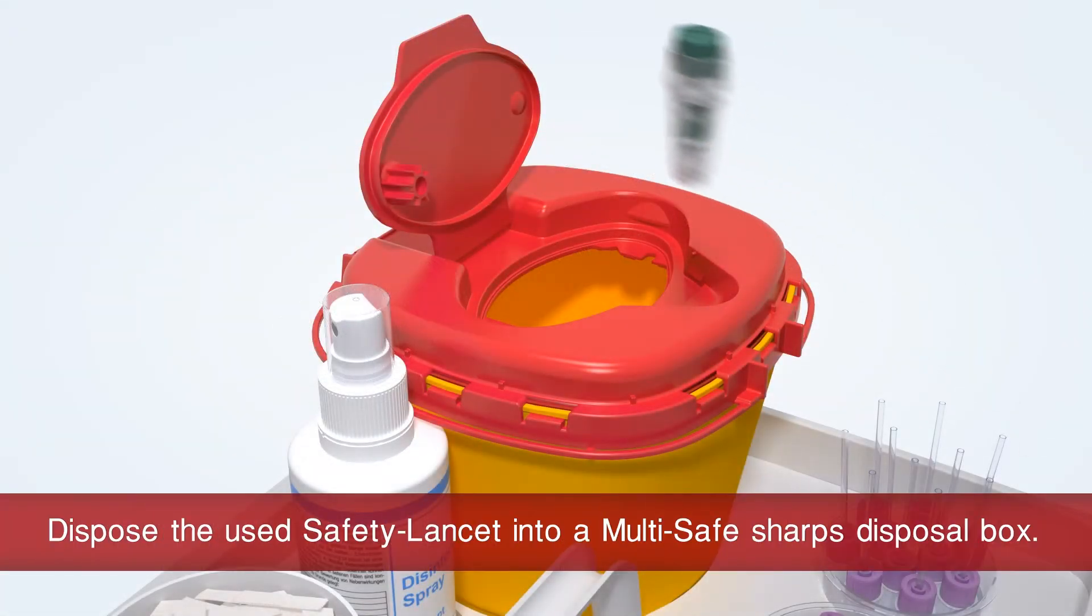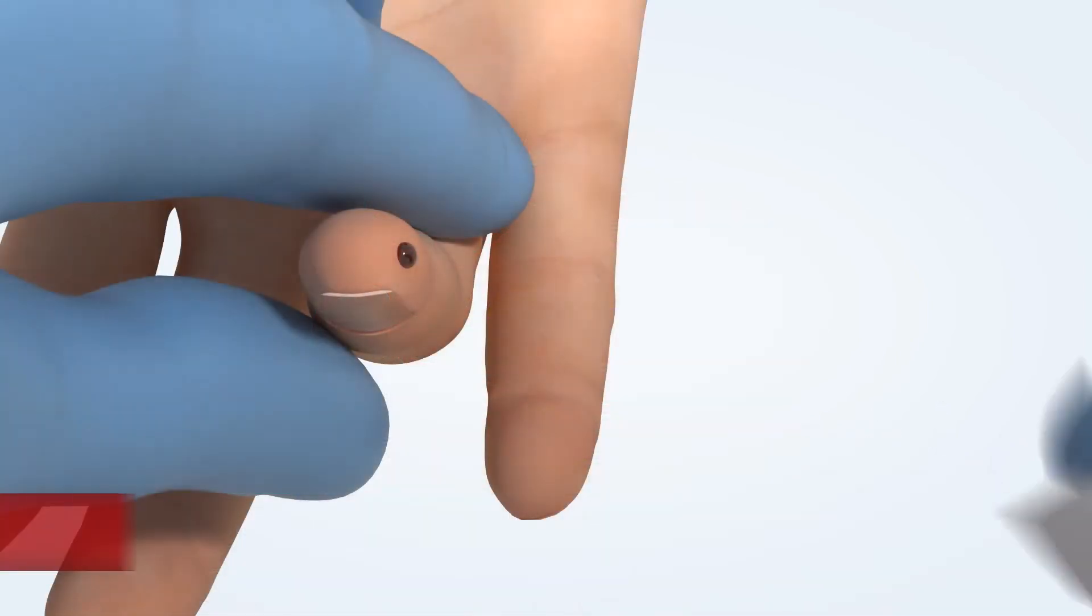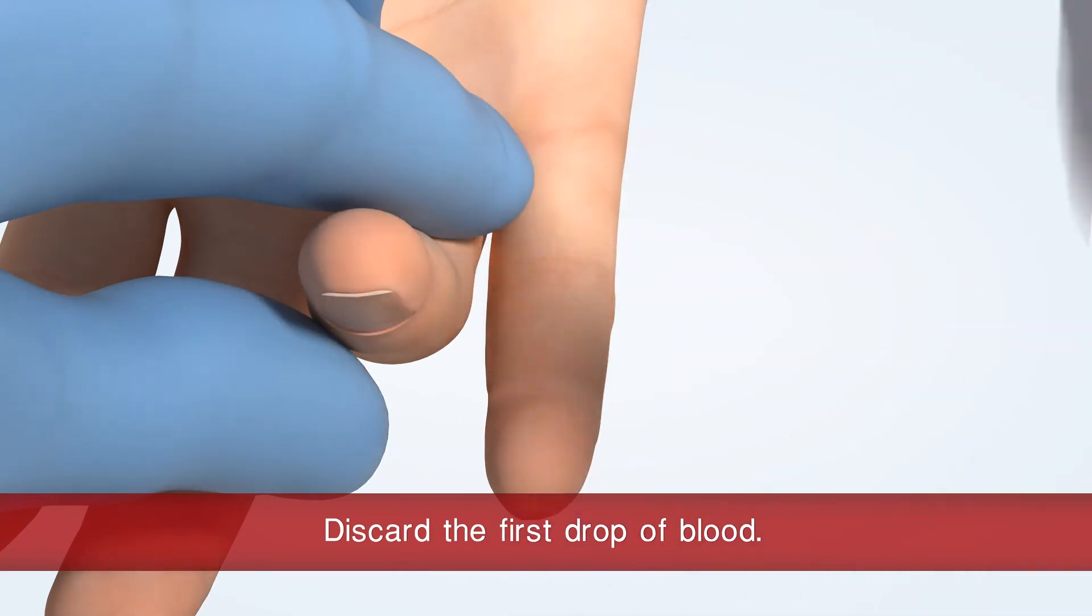Dispose the used safety lancet into a multi-safe sharps disposal box. Use a swab and discard the first drop of blood.